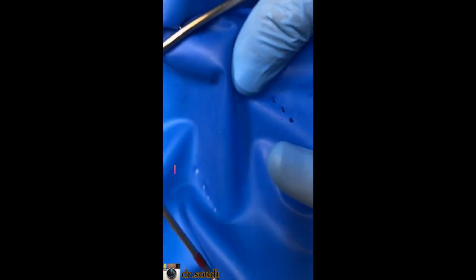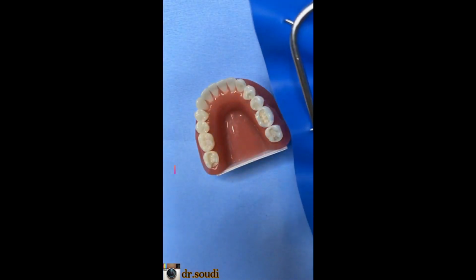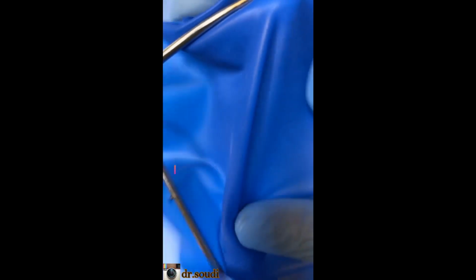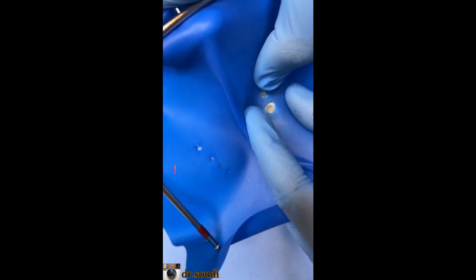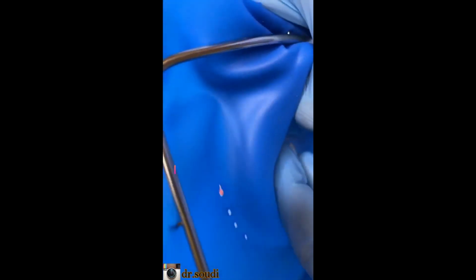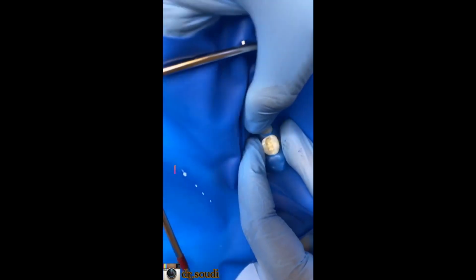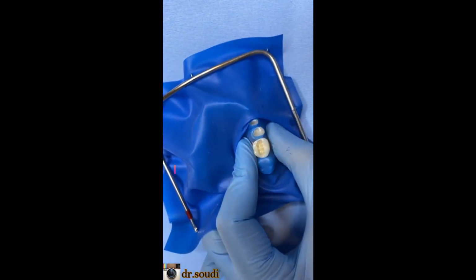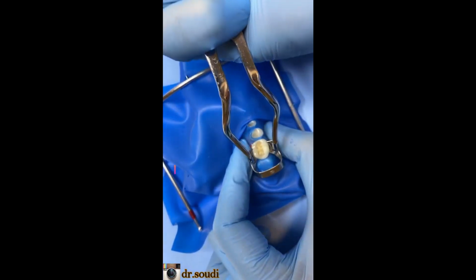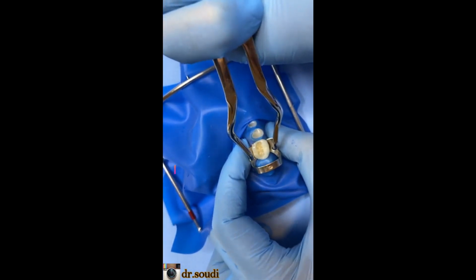We have now the 4 holes. Now I will work like the sheet and frame together, and I will place the clamp afterwards. So I will stretch it like this, more stretching. Like this, more stretching like this. I will take a clamp, let's say it's the 26 like this, and place it smoothly, don't press.